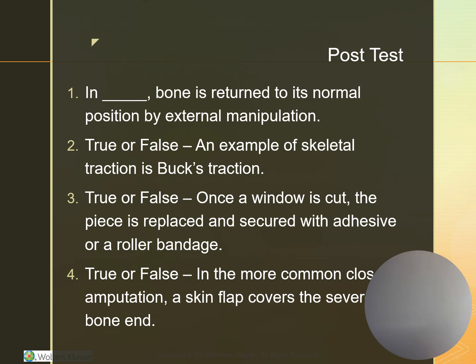When we're using walkers, make sure that the client is pushing or lifting the walker just a few inches in front of them, walking into the walker. Then they lift or push the walker ahead a few inches, walk into the walker. Do not let them push that walker so far in front of them that they become unbalanced. That will create a fall risk.